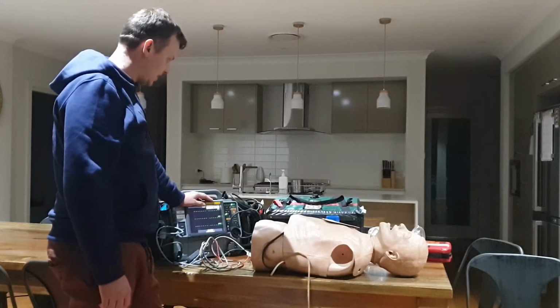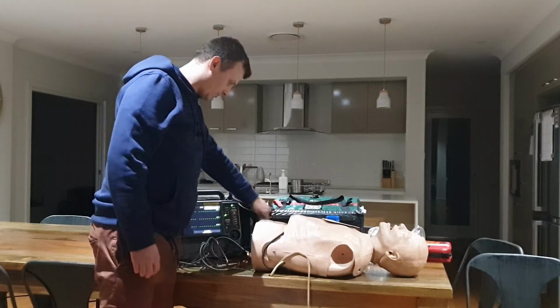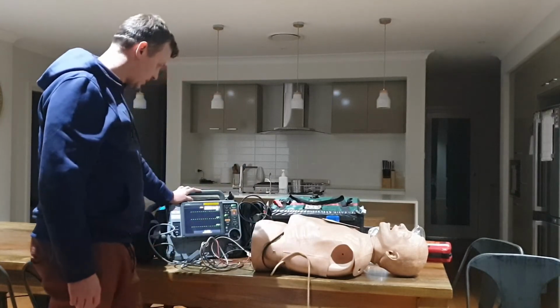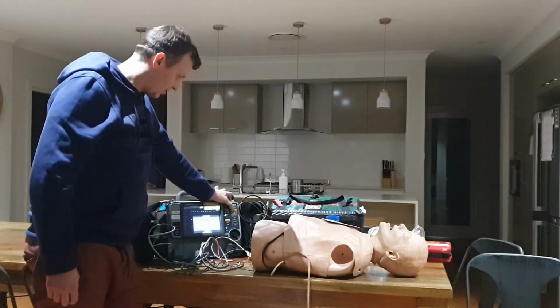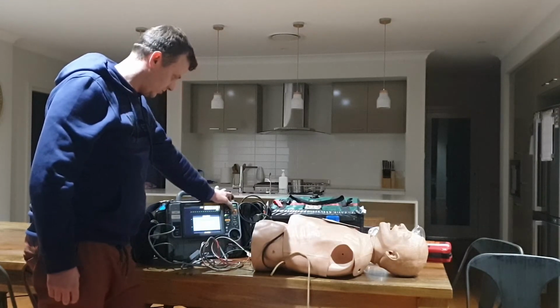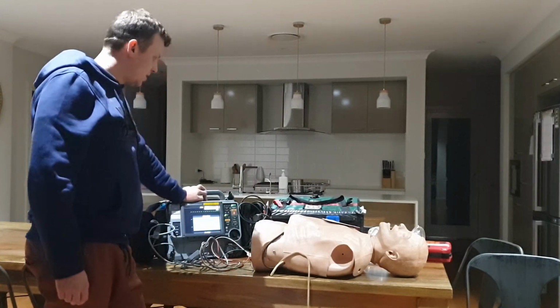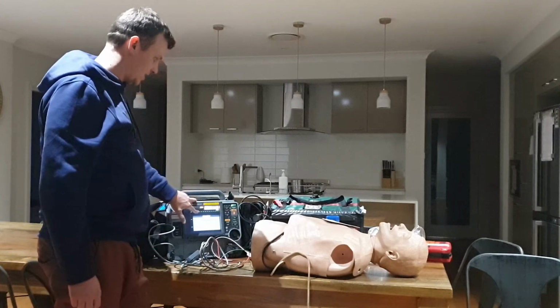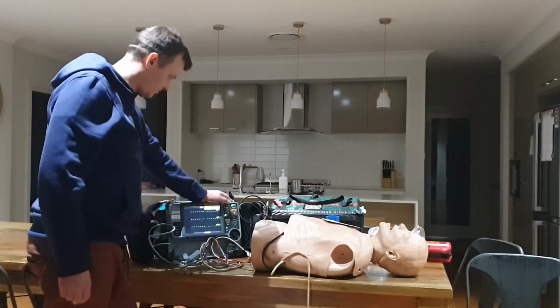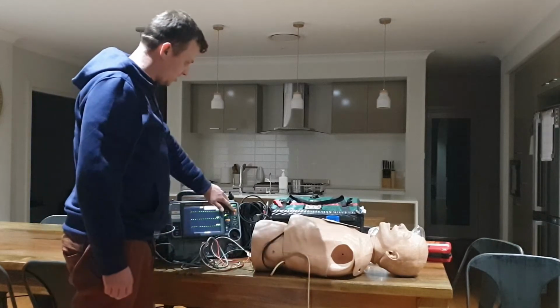Now, with the energy select, you start off with the first shock. You want to go to 100 joules. So you just select your energy, which is the button on the right hand side here, and you can go up or down. So we just want to go down to 100 joules for the first synchronized cardioversion. Then we've got it synced to the R waves, making sure it's lining up. Then you're going to charge.